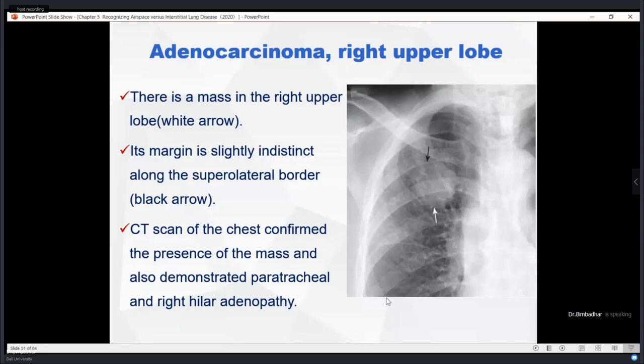Did you understand the question you asked before? How can I differentiate between a Ghon focus and an adenocarcinoma? The density does not appear as calcified as in tuberculosis. The lesion usually appears with no calcification, but it is very heterogeneous.